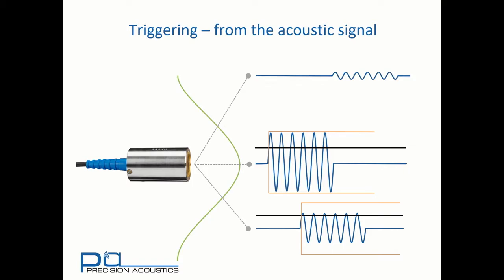We'll now consider a position that's a long way off axis. Here, the distance is increased, and therefore the time delay for the signal to get to the hydrophone is increased further, and similarly, we have a smaller acoustic signal. This time the signal is so small it doesn't even cross the trigger threshold level, and therefore in this location, we'd fail to gain a successful acquisition.